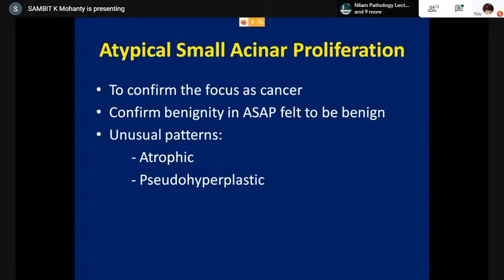Predominantly when we use this, it is on the needle core biopsy. I'm not talking about when the tumor has gone into some other site. As well, within when we do IHC in a prostate biopsy, not something outside. When it is outside, you do prostatic markers. Those are PSA, PSMA, PSAP, prostein, and NKX3.1 and AR. Those are not the stains we classically do in a needle core biopsy unless it is small cell or something like that. So when we do, we want to confirm there is cancer or not.